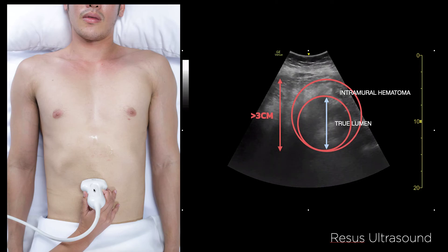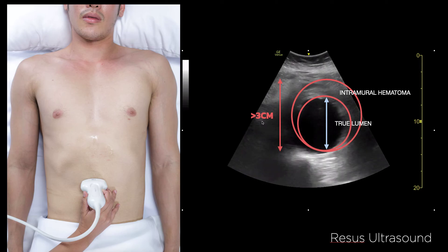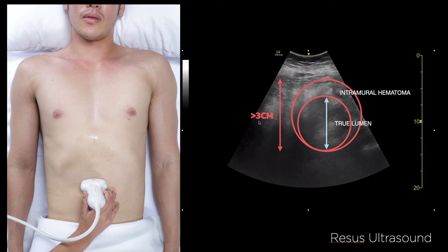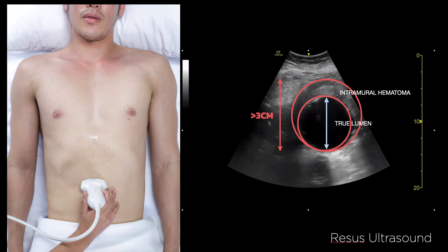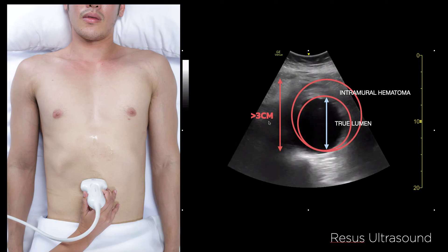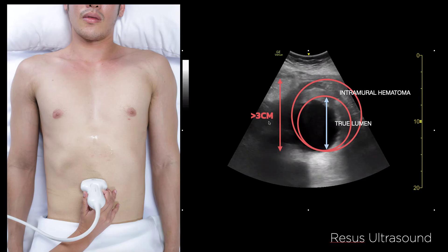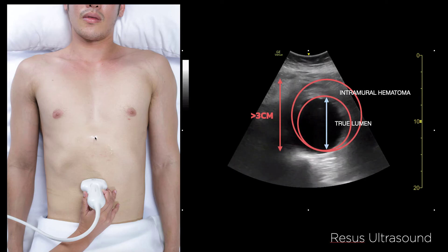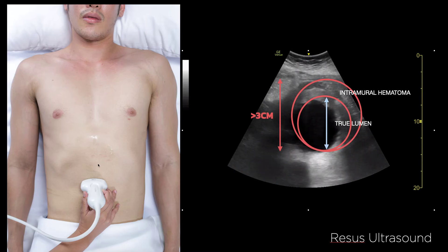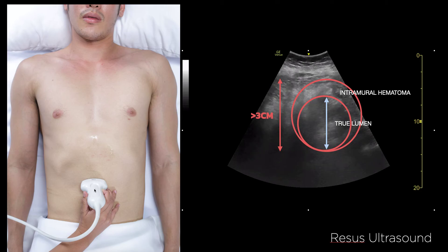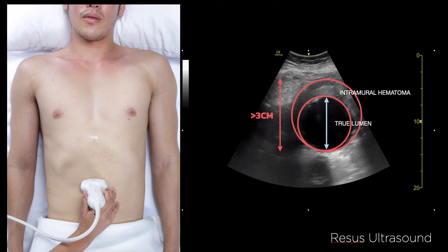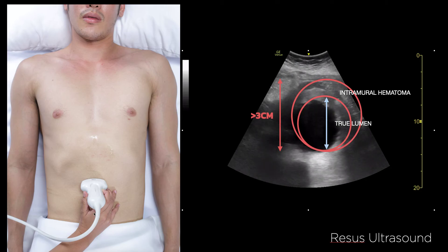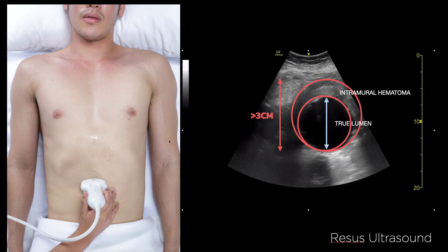At the aortic bifurcation, the diameter would normally be more than 1.5 centimeters in an aneurysm. So to summarize: above the umbilicus, more than three centimeters is abnormal; below the umbilicus, more than 1.5 centimeters is abnormal.